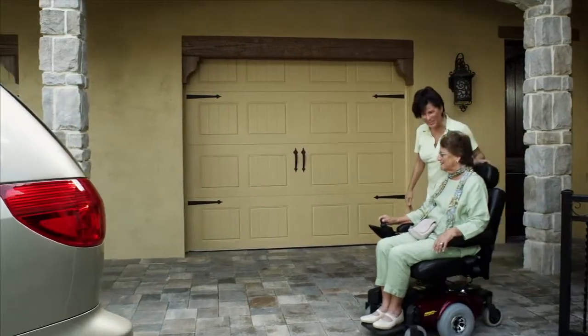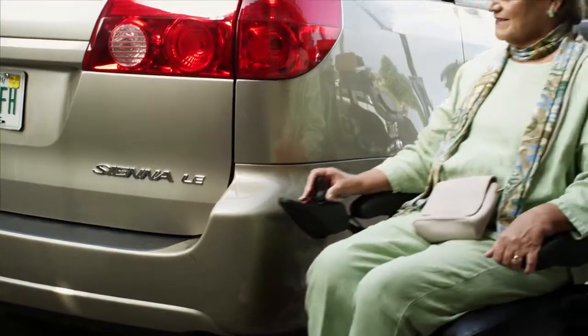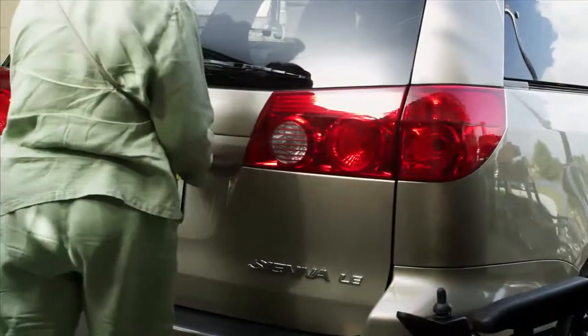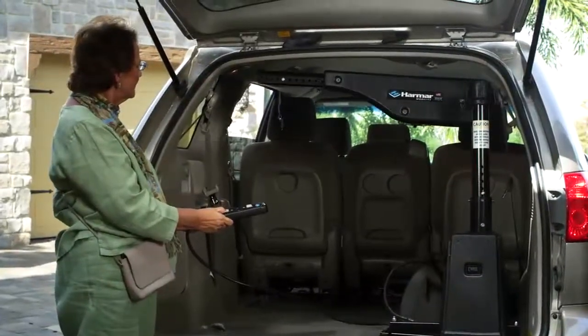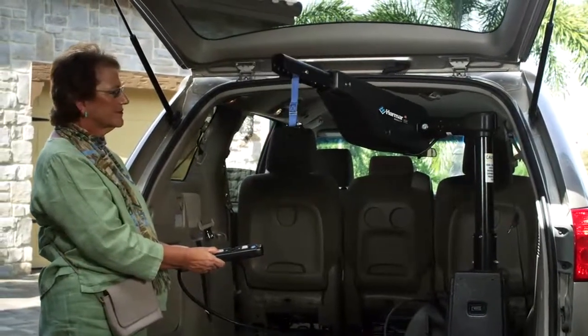Going out for lunch at a movie is a very important time together for mom and her daughter. Taking mom's power chair with them is an easy task with their Harmar Premium Inside Lift. To quickly load it inside the vehicle, Harmar lifts are simpler, stronger, lighter, and easier to use.